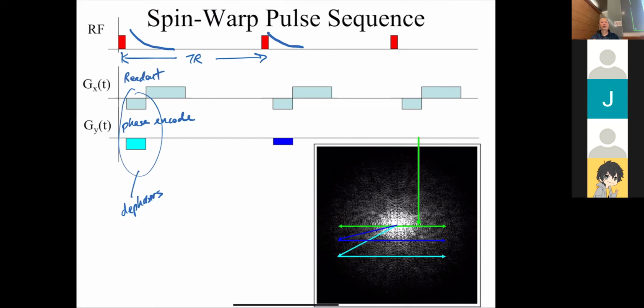So with GX and GY, every spin is just precessing, but every spin precesses differently depending on GX and GY. That's where you have to think about all the spins, and that's where we talk about the phasor patterns. Say I have these two fingers, and I flip them. They start spinning differently, depending on where they are. Initially they spin the same because I'm at the center of K space, but as I apply these gradients, they start spinning differently. I have to think about all the spins over all the space, acquiring different spatial patterns.